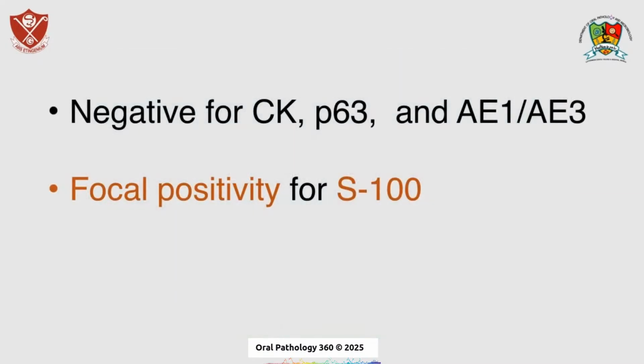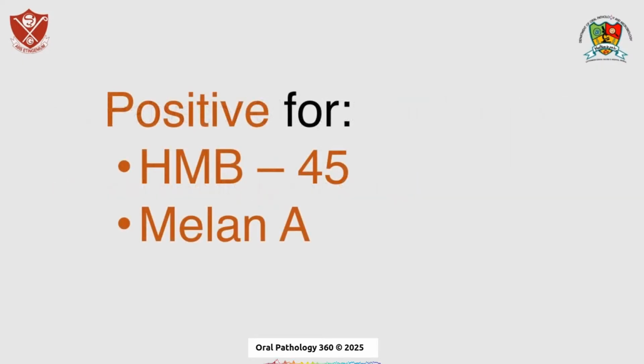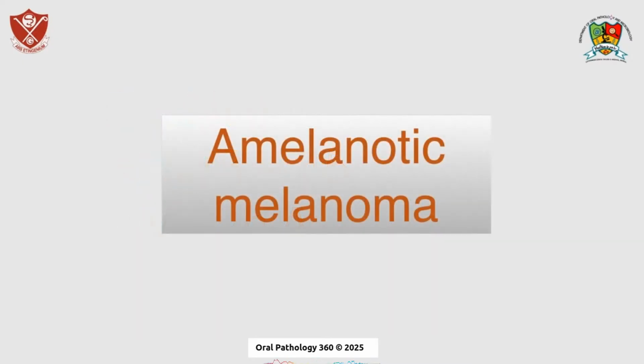These cells were found to be negative for CK, P63 and pancytokeratin, were focally positive for S100, but they were positive for HMB45 and Melan A. Based on this finding, we gave a diagnosis of amelanotic melanoma on the incisional biopsy.